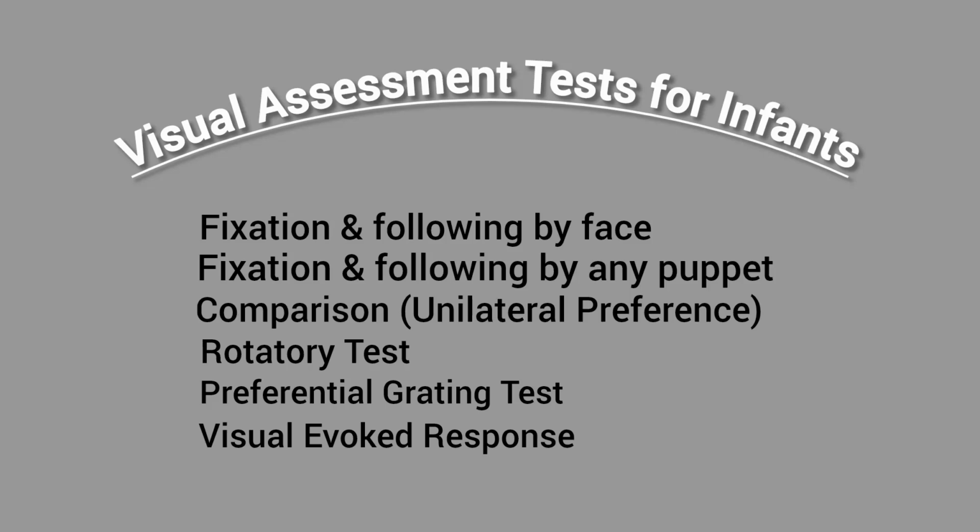And there are other tests which you can perform in infants, that include retinoscopy, after giving the patient a sedative in the case of infants, because they cry a lot. So you can give them sedatives and you can do retinoscopy for the assessment of the vision. There are a lot of other tests, but these are the basic tests you can do in infants in order to assess their visual acuity.